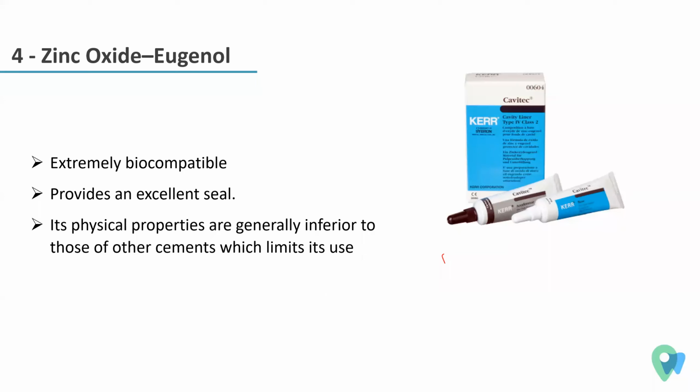Zinc oxide eugenol is extremely biocompatible and provides an excellent seal, but its physical properties are generally inferior to those of other cements, which limits its use.